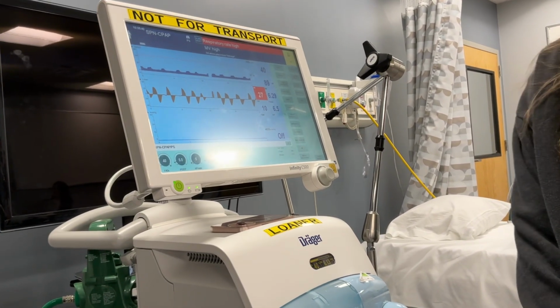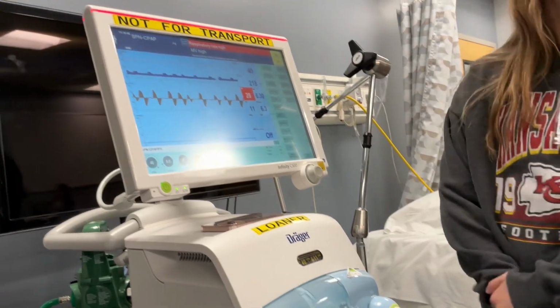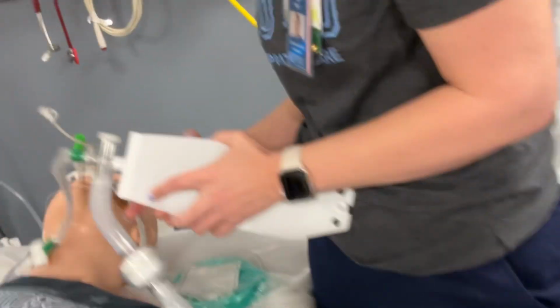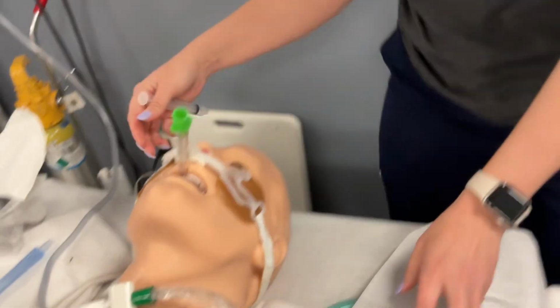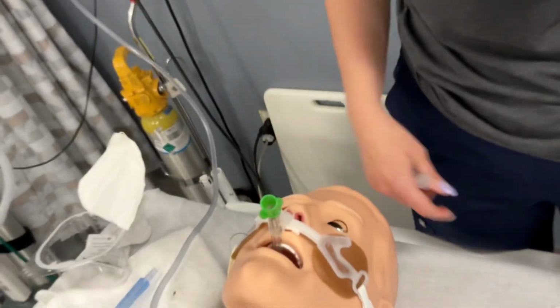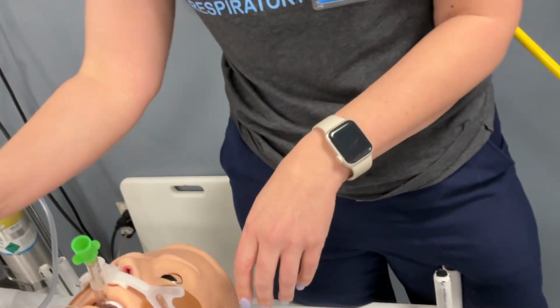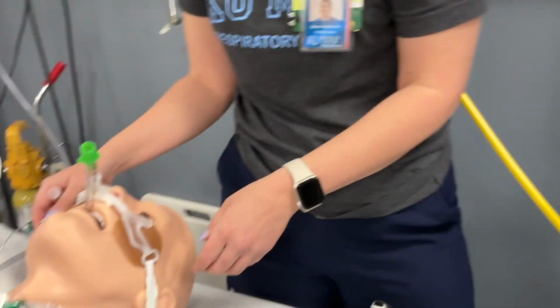Good job. So Brett qualified for extubation. Now you're going to extubate Brett. Now I have a tube in, so we can go ahead and do this. If you want to watch me, or just look at your video, can you put that on standby for me? So, alarm reset.